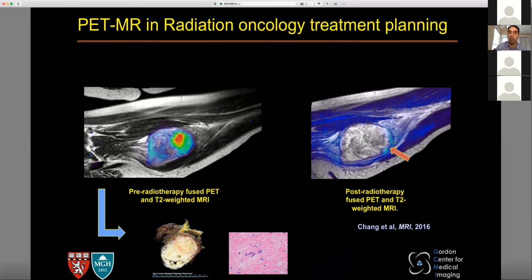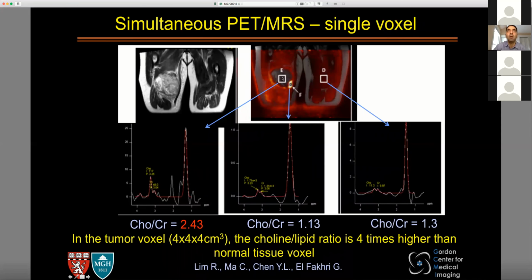And then if you have an MR, you could look at spectroscopy and confirm that this area is a tumor, that's where the tumor was. This area is normal, that's the contralateral side. And this area in question has the same signature as the healthy tissue. So that's not a tumor. And sure enough, following the patient over time demonstrated that wasn't a tumor. So that allows us to follow the patient over time with a PET-MR and determine whether or not they should come back for treatment or not without any need for surgery.